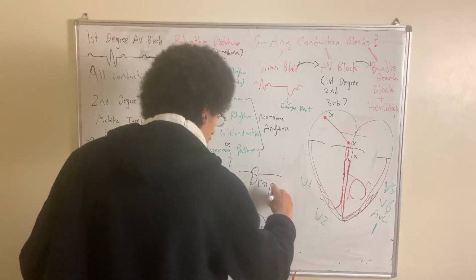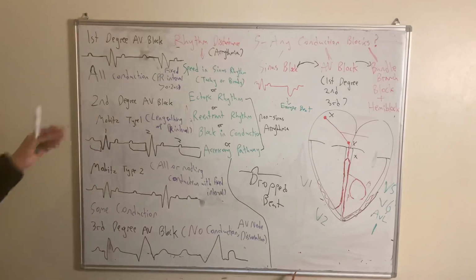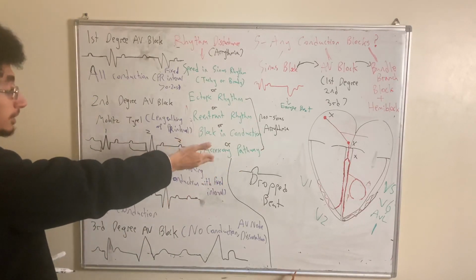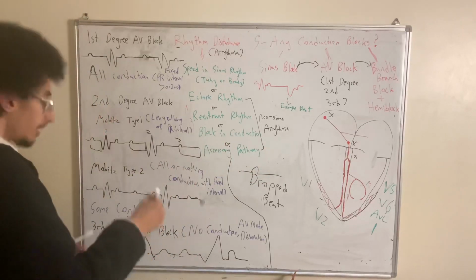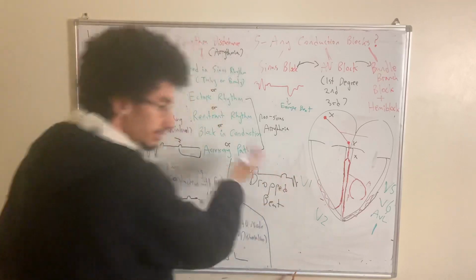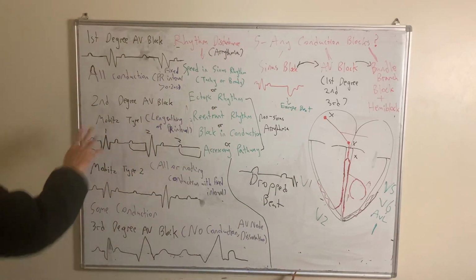Now, we finished with Mobitz type 1. And if you're wondering, it will reset. Meaning it will not just be asystole. Eventually, it will reset and you will have the same issue.